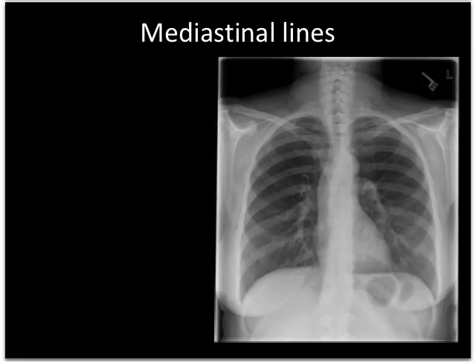Regarding the mediastinal lines, I cast my eye around all of those. Make sure the right paratracheal line isn't enlarged, that the azygoesophageal area looks okay, nothing going on in the region of the superior vena cava. I can see the aorta, the azygoesophageal line, and the descending aortic line all the way down. We should be able to see all of these — if we can't, we need to know why.